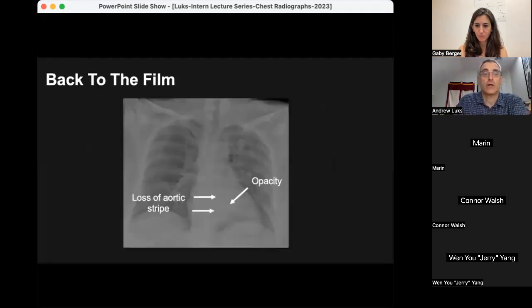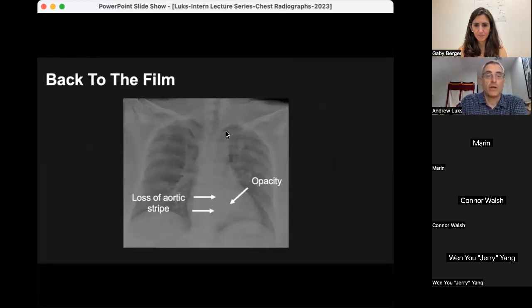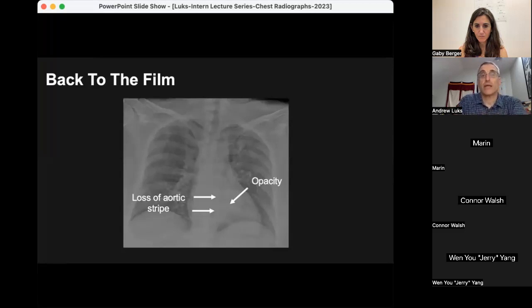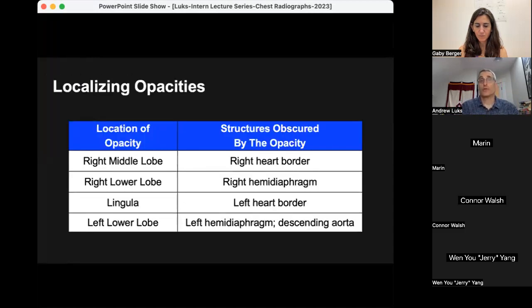Going back to this patient's film: notice that the descending aorta is initially visible but then the aortic stripe is lost, and there's also opacity in the retrocardiac area. There were findings on this patient's chest radiograph suggestive of an opacity that could be consistent with pneumonia given her symptoms, and the CT might not have actually been necessary in this case.